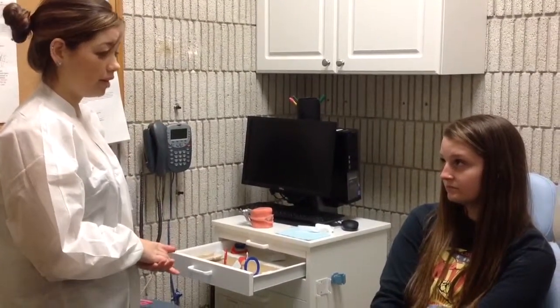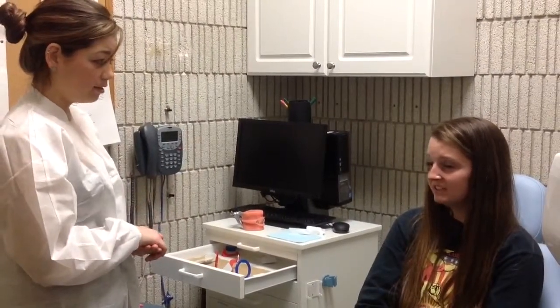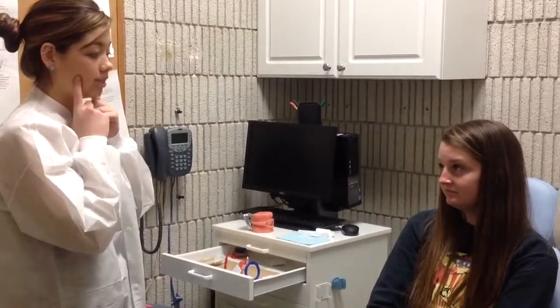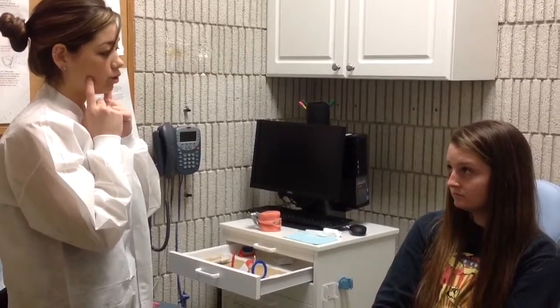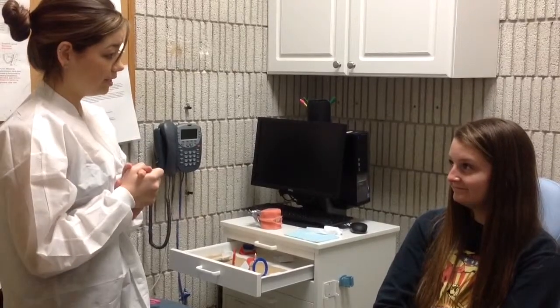Mom said that you did fall last week, and it's still bothering you a little bit. Hurts, yeah. Is it wiggly at all? I hope not. Okay, we can take pictures today, and we'll see what's going on under there. And we're also going to take pictures of your teeth on the side. Those pictures are going to show us if you have any cavities in between those teeth. Those pictures will show us anything that we can't see when you're sitting in the chair with the mirror that the doctor uses. Okay. Do you have any questions?